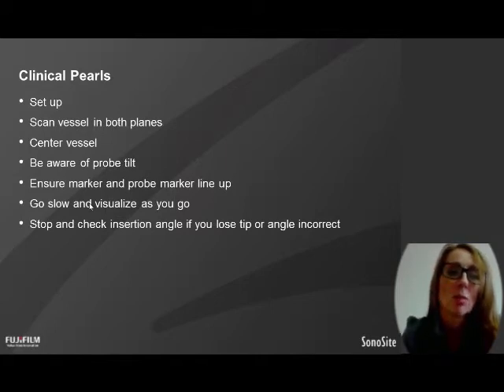It's worth the effort. The other thing is just don't set your staff and your patients up to fail. Give them the training. Take that little bit of effort. Remember that it is a new skill, that even though you may have some of the best expert cannulators and expert clinical assessment staff in your unit, that doesn't mean that they don't still need to be supported and trained in this new skill. And they shouldn't be hard on themselves and expect that they can do it. It should just be an expectation that this will require extra training. So have a really good competency assessment package in place.